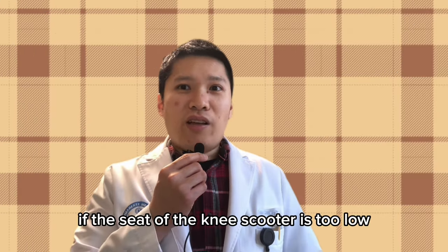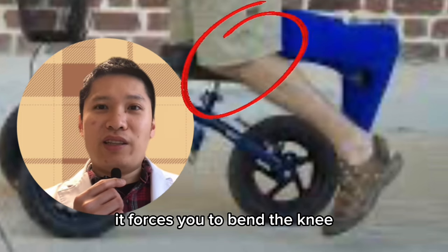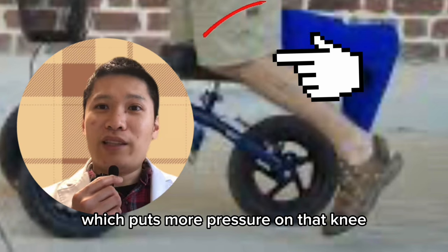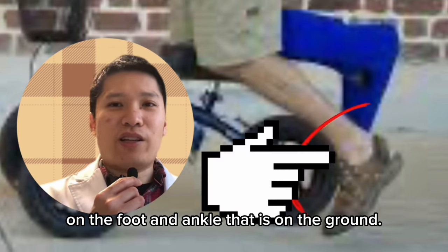On the other hand, if the seat of the knee scooter is too low, it forces you to bend the knee, which puts more pressure on that knee as well as more pressure on the foot and ankle that is on the ground.